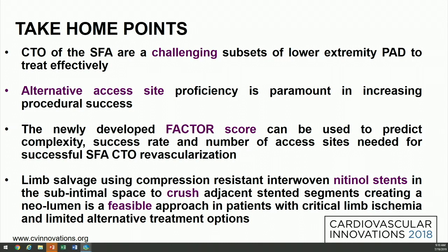So I've done one where I've only used one Supera behind the knee to crush the previous stent, and it usually works well. These stents are pretty solid radial strength. You overlap them if you need longer segments, but I don't know if necessarily you need to put 2 stents inside of each other. No, the overlap was not too big. I'm just saying, it was a very long segment that needed the 5 stents, and the high stackability is correct. I see. Correct.